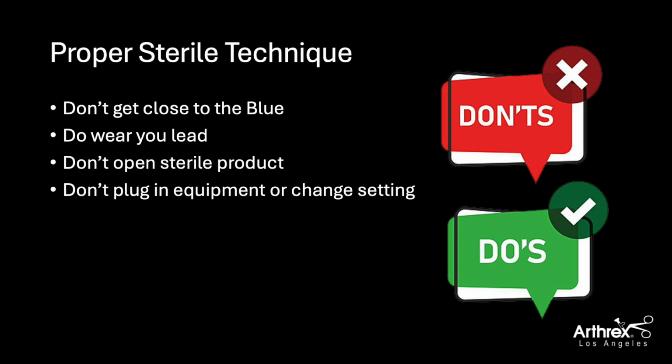Once you're supporting the case, we want to make sure that you keep sterility a number one focus in these cases, due to all of the different cords and devices coming off the field. It's important that we stay 3 feet apart from the field itself and some of the cords, due to the heightened sense of sterility. I think also it's important to make sure that you have the circulator plugging in the camera source, plugging in the RF probe, plugging in the drill motor or motor piece that's needed. I think that will go into our sterility field on that aspect.